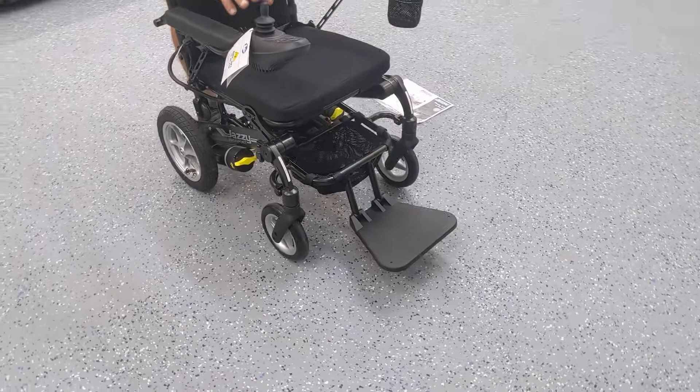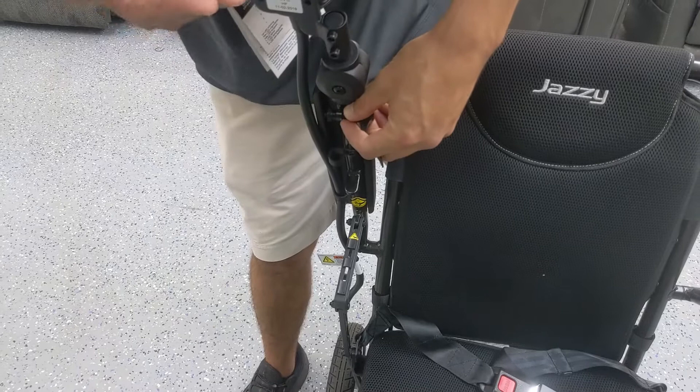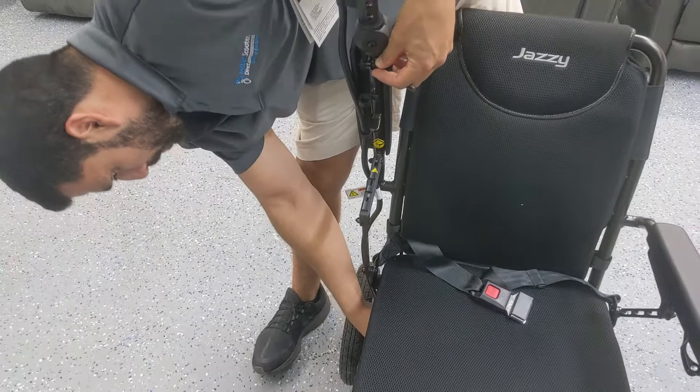The chair comes with two armrests and you can mount the joystick on the right or the left very easily by simply loosening this bicycle-style clamp, sliding the joystick out, disconnecting the cable, and moving it to the right side.